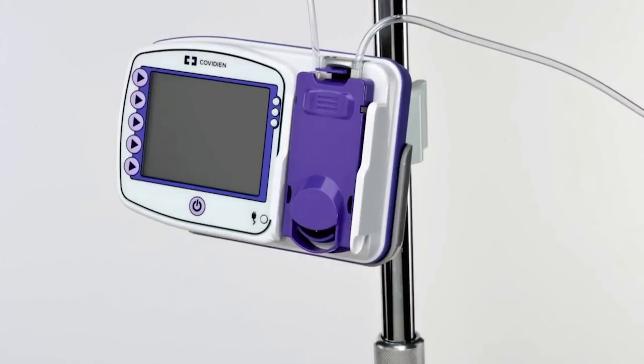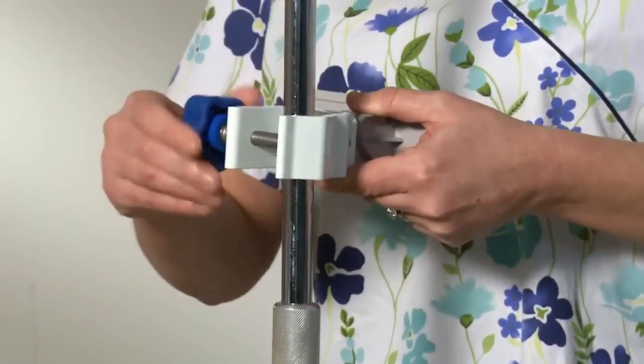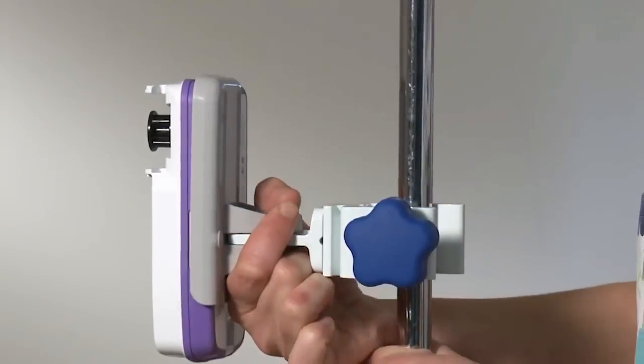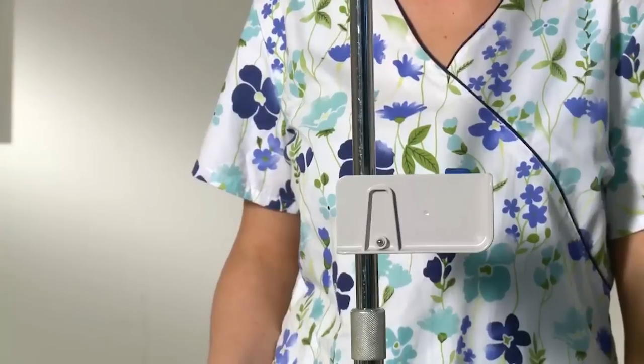The Kangaroo Connect enteral feeding pump can be attached to a vertical pole using the pole clamp included with the pump. Tighten the knob so the pump does not slide down the pole. The plastic retention plate is designed to be rotated in 90 degree increments to allow attachment to a horizontal tabletop surface or a horizontal bed rail.